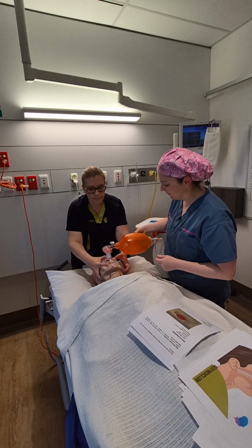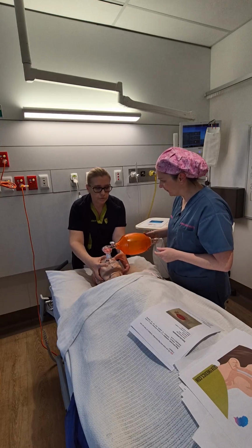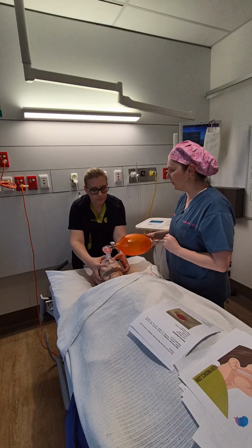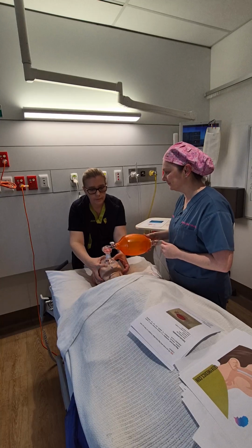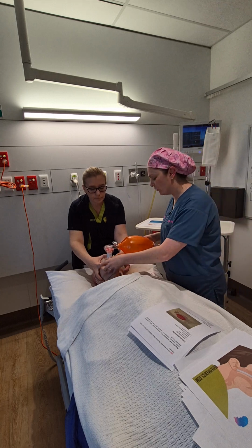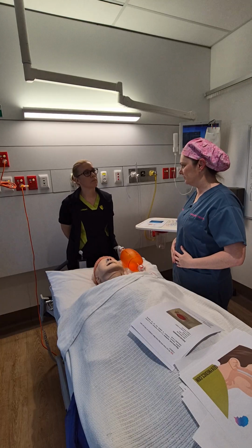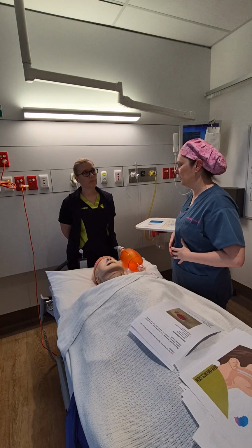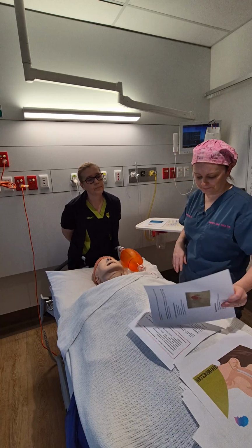And what about if my patient had chronic obstructive pulmonary disease? You'll just do little breaths. Still do your maximum oxygen, and just ventilate and get your sats as best you can. Okay. That was a very good question. Thank you. So just be careful with your technique. If we don't open the airway effectively, essentially it goes all into your belly, which is not what you want. You want it to go into the lungs, and if you get too much air in the belly, you can also cause aspiration, which we don't want.